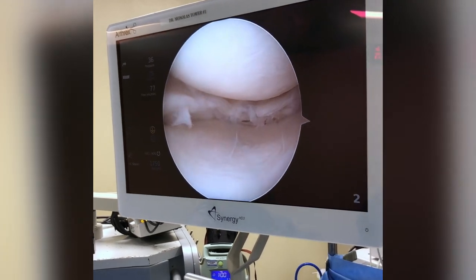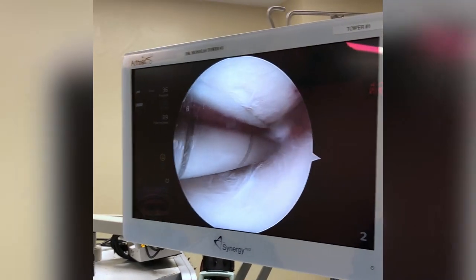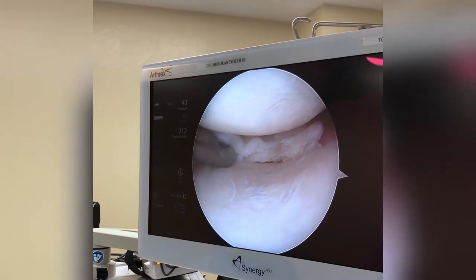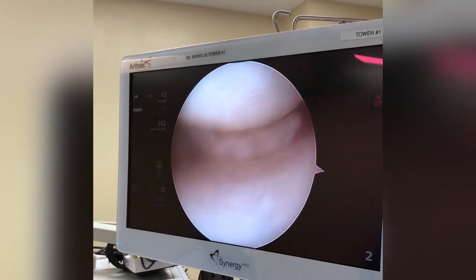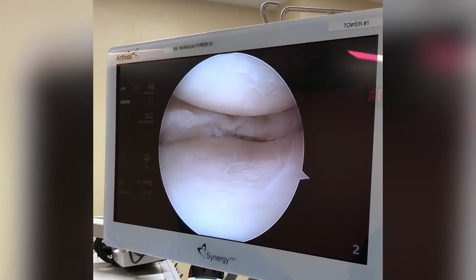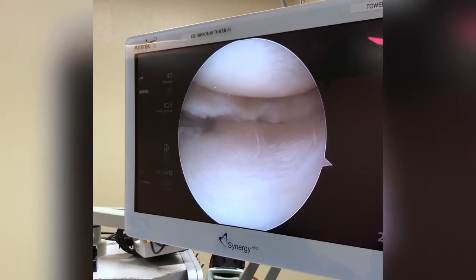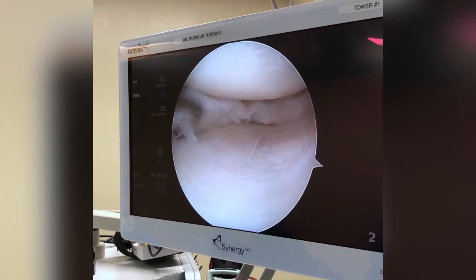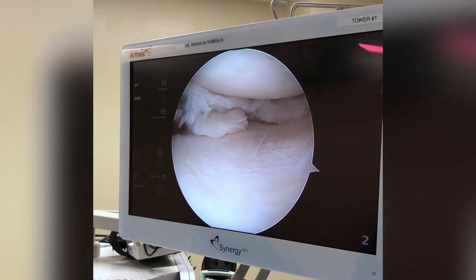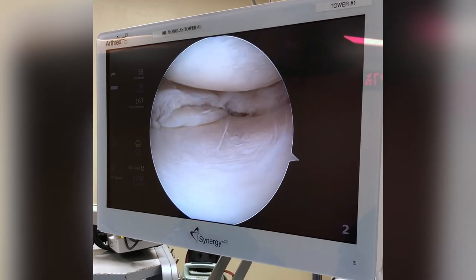It's a big tear. The shaver is a 4-0 — pretty decent sized tear there. The key with meniscus tears is to trim out what's torn and make sure that the remaining meniscus is smoothed to a stable rim. You see how, by being careful, I noticed that this part is unstable as well — so that has to be removed too.